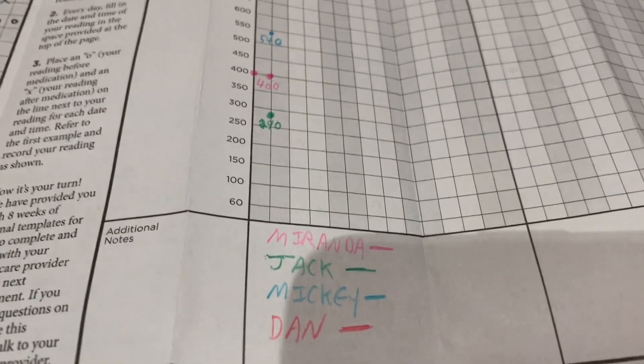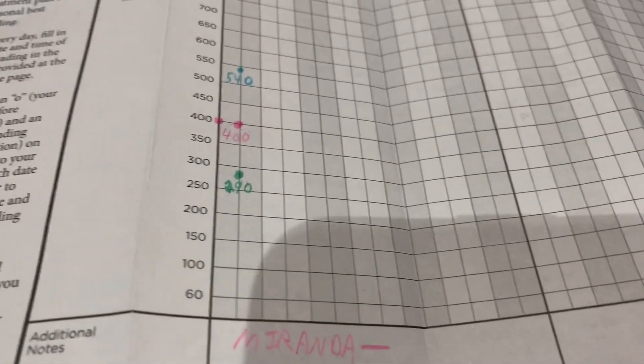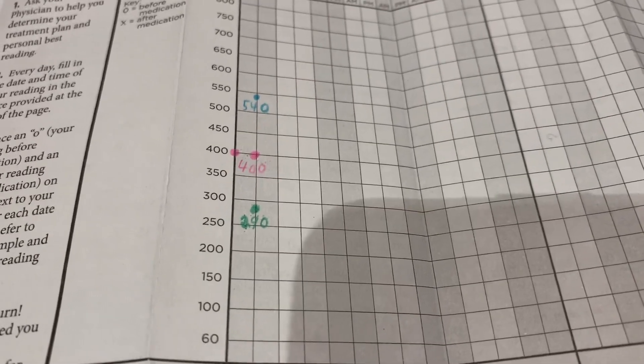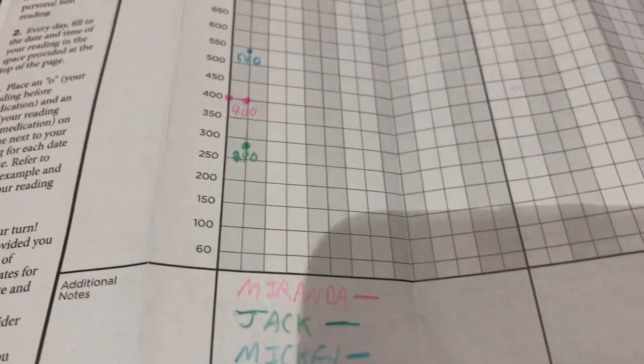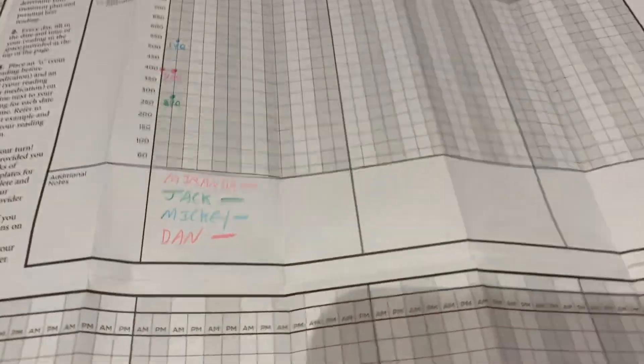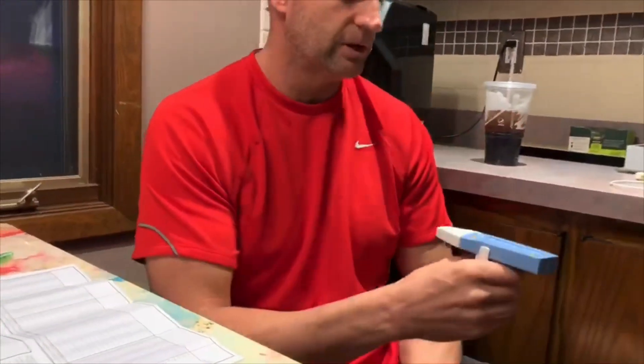So far, Miranda's got 400, Mickey's got 540, and Jack's got 390. Now Dad is going to try. We're going to start charting every day and see if we notice any increases or decreases. I haven't done this in a couple years, but I want to start doing this every flu season. Let's see the best we can do.